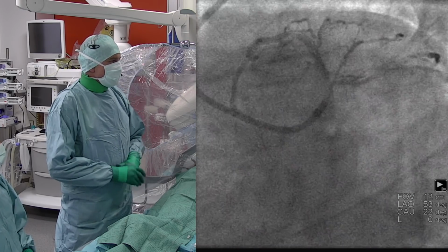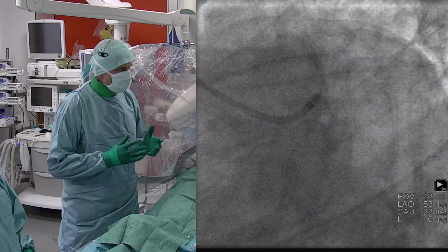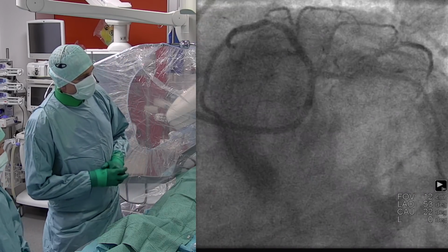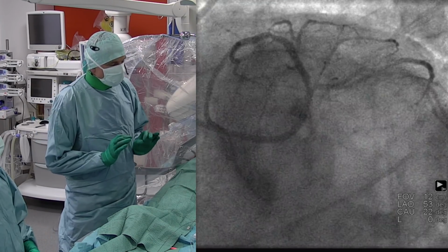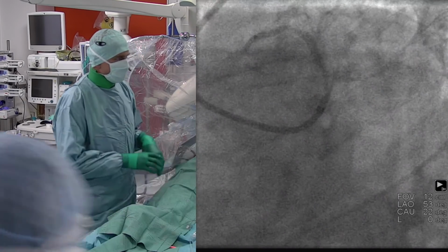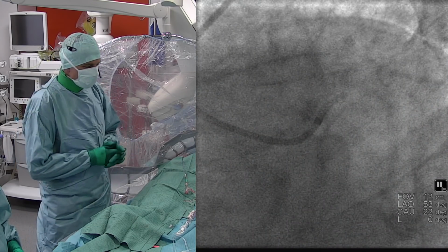And there we see again the left main in the spider view. You see, from here, to be honest, if you are a little bit sloppy, you would say, well, there is a little bit of wedging with the diagnostic catheter, but nothing to write home about, and you would neglect that. Fortunately, I would say we had a serious wedging, so our eye was caught by what was seen on the pressures, and we went a little bit further. And this is probably what we are going to do now.